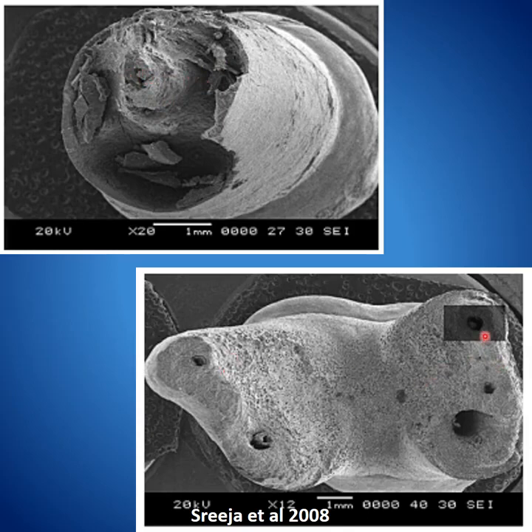And this is another tooth whereby you can see the external resorption and how much resorption has been done, and you can see that the foramen has been changed in position and size.